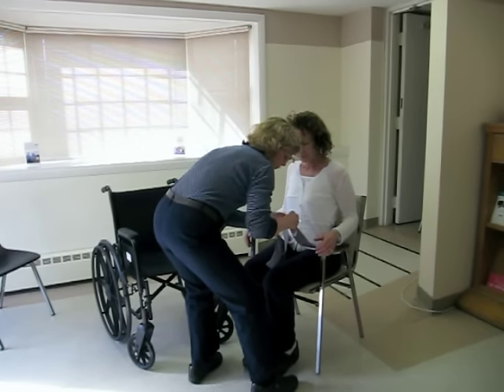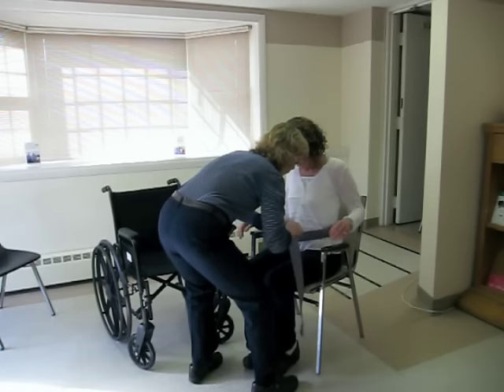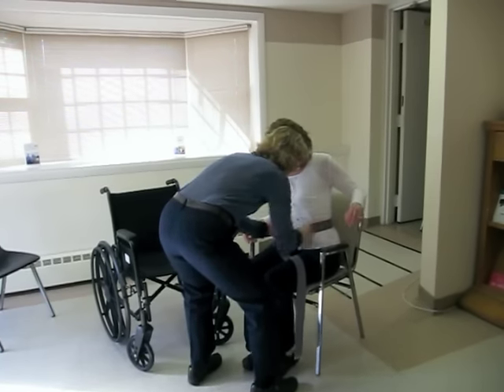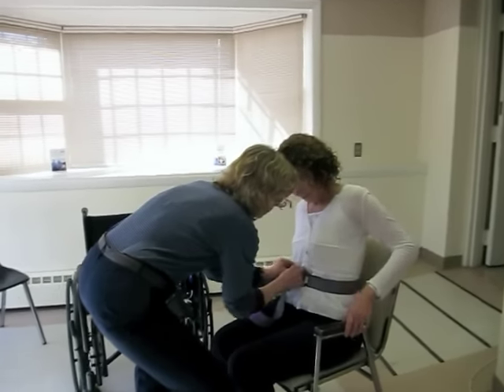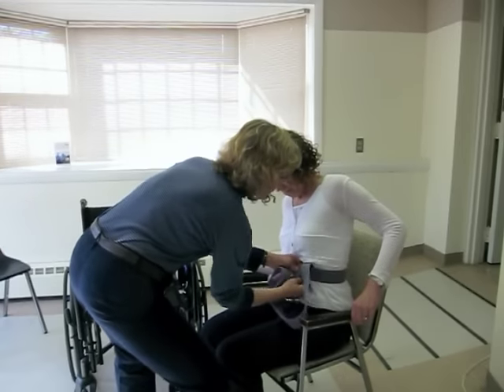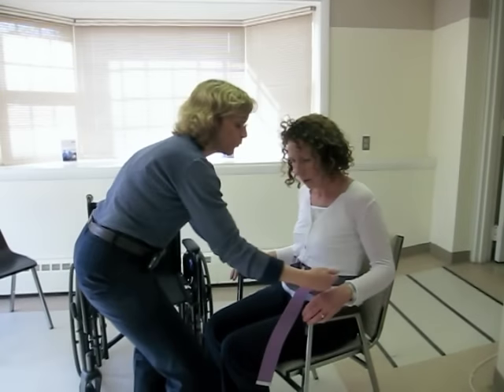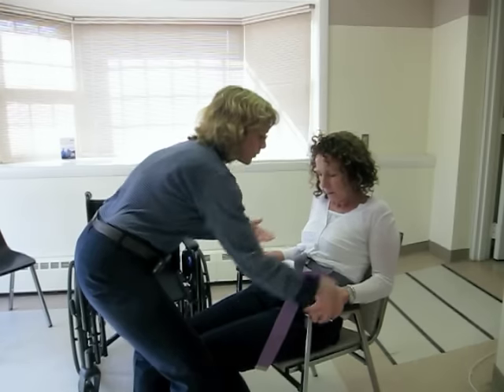You're going to snug it up at the waistline so it's not going to travel up the body. Then have the patient first move forward — push your back against the chair and slide forward and sit all the way forward.